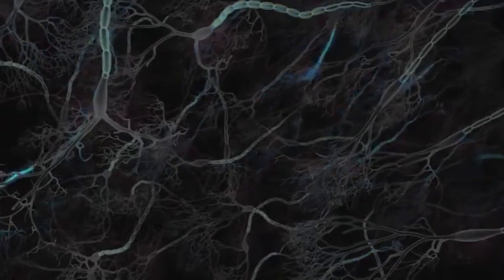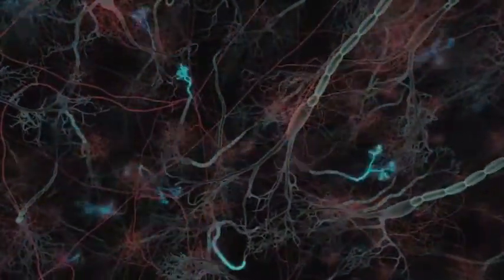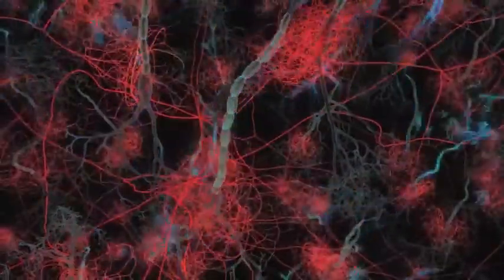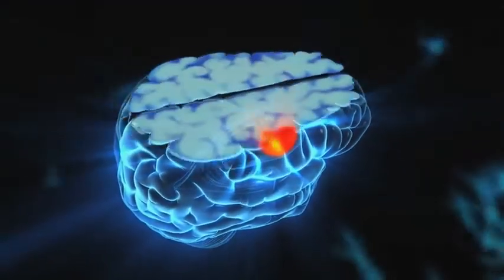The basic idea is that neurons are like muscles. So if a part of your brain turns on, say right here, and the neurons start firing there, it's just like using a muscle. You need to send more blood to supply those neurons because it's metabolically expensive, just like running with a muscle. And so what happens when more blood is sent to that part of the brain is that the amount of oxygenated hemoglobin in that part of the brain changes. And that has a magnetic signature that we pick up with functional MRI.